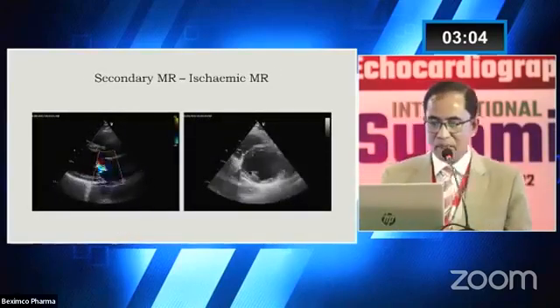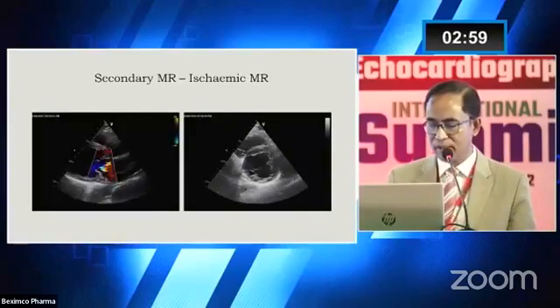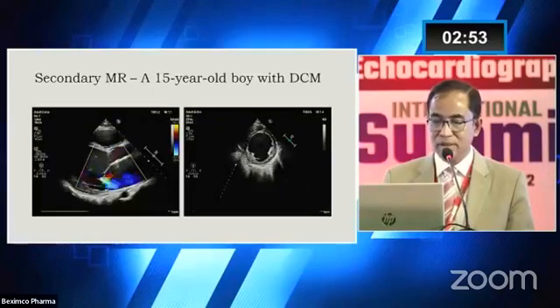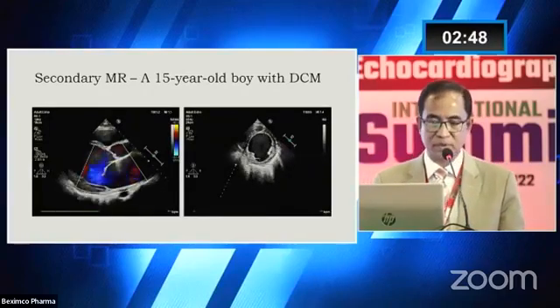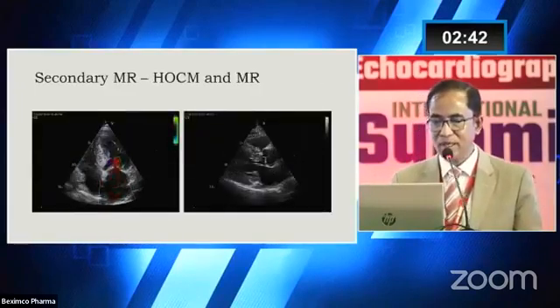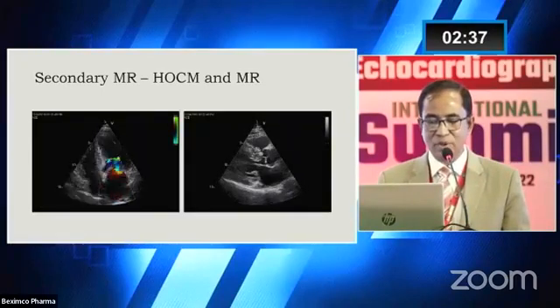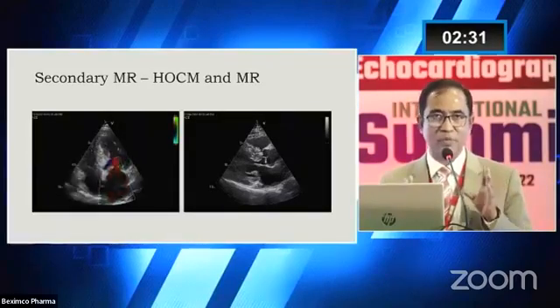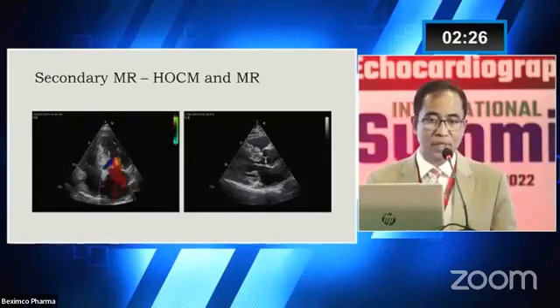This is an example of secondary MR — the posterior wall is virtually akinetic, causing papillary muscle dysfunction and MR. This is a case of a 15-year-old boy with dilated cardiomyopathy, where the secondary MR is due to dilatation of the annular ring. This is an example of hypertrophic cardiomyopathy, where the valve itself may be abnormal, or the valve may be normal but with abnormal motion due to significant systolic anterior motion of the mitral valve.